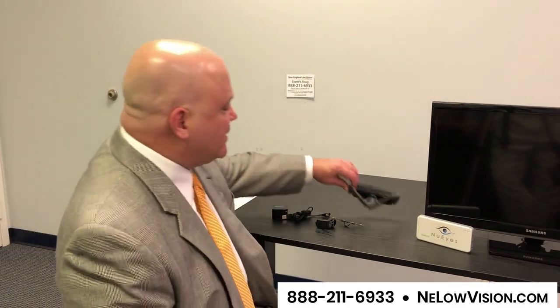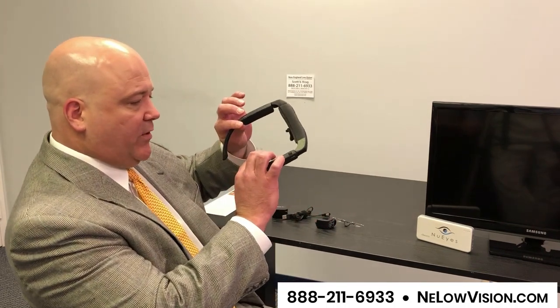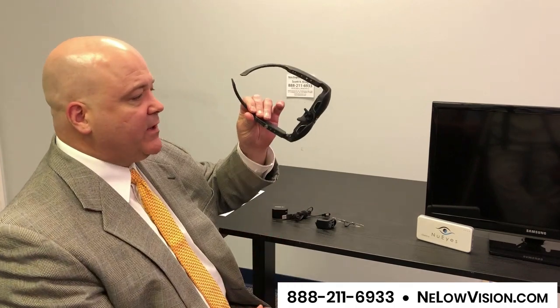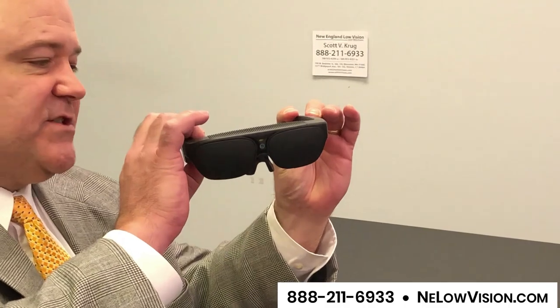Hi, my name is Scott Krug with New England Low Vision and Blindness, and today I'm going to show you a product called NewEyes. One of the first things about this particular wearable that you can notice very quickly is just how slim and sleek it is — it looks like a pair of sunglasses.